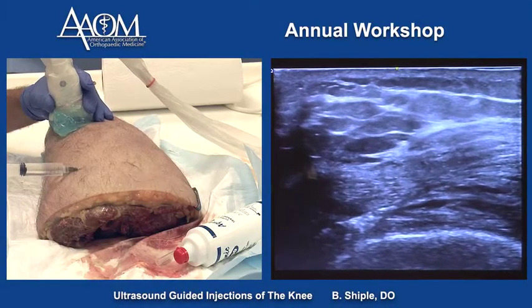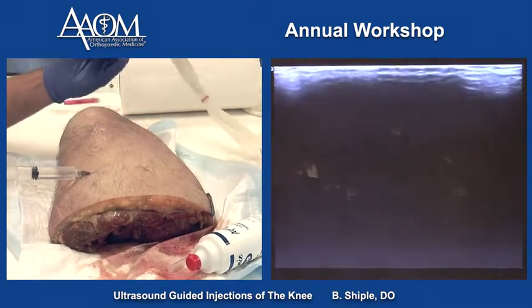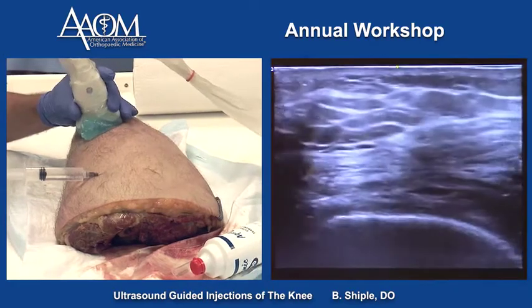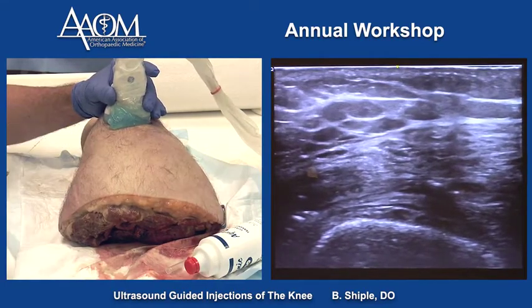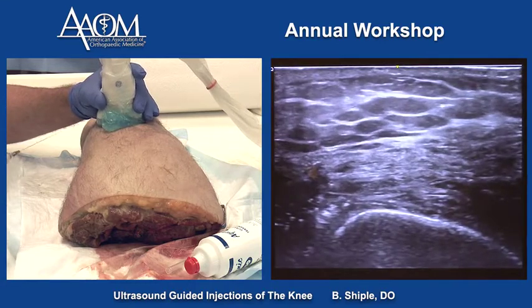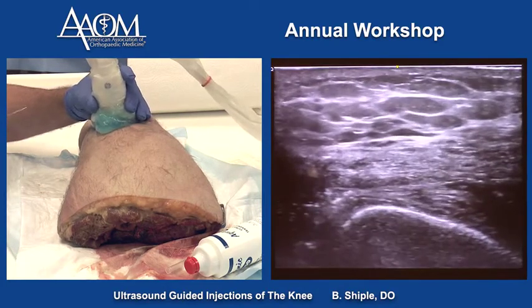We're going to inject the knee joint using the standard suprapatellar pouch lateral approach. The probe goes short axis over the quadriceps tendon, and we're going to take our needle, bevel up, and aim for the potential space between the quadriceps tendon and the fat pad, which lies right over top of the femur. And we are ready.